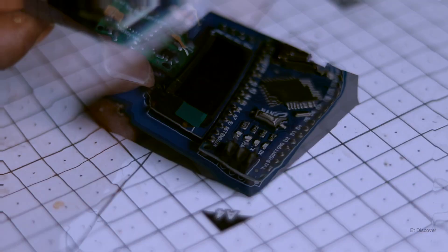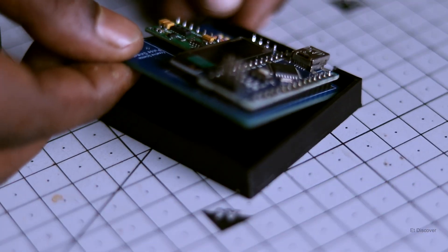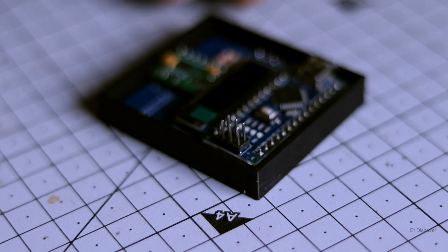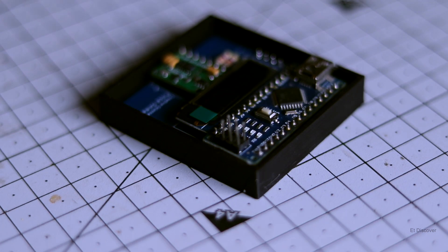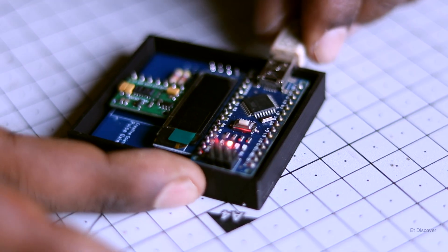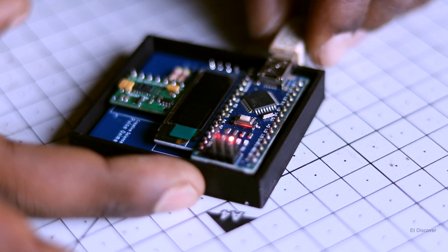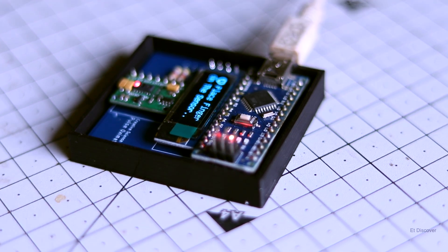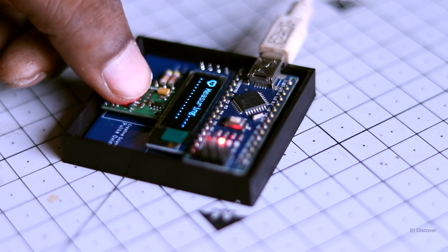So finally I made a small 3D printed box for this for looking good. Maybe you can make a better box for it for more decent look. So you can see once again, my oximeter is showing me good accurate results.